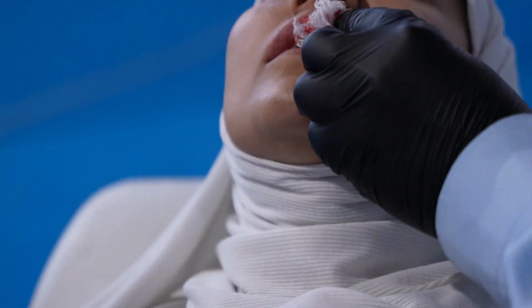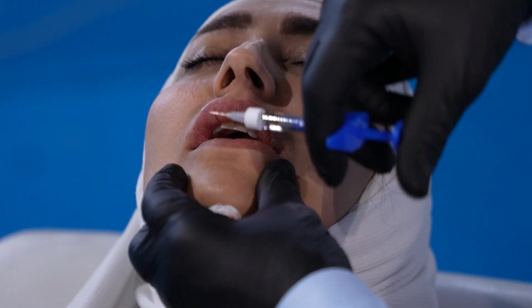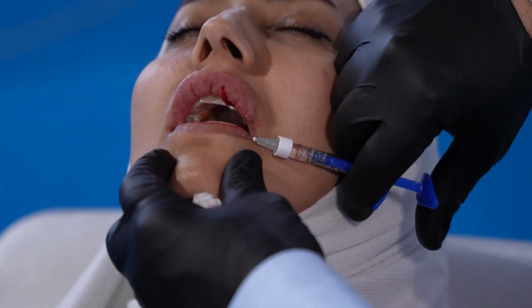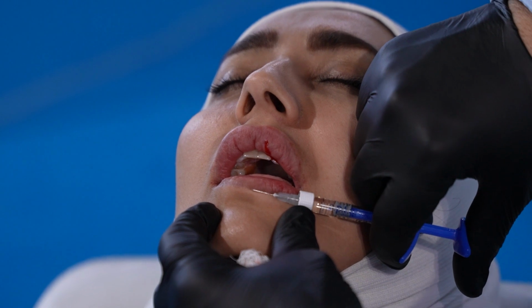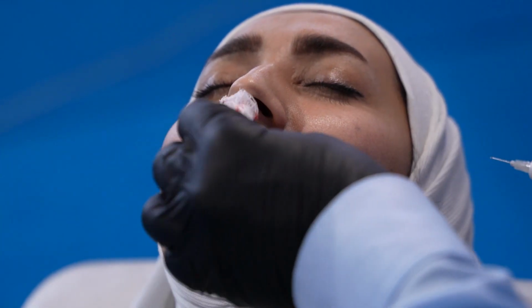The same thing for the lower lip. For the lower lip, usually we have only the two halves, one and two. We will just inject to the middle half of each side.